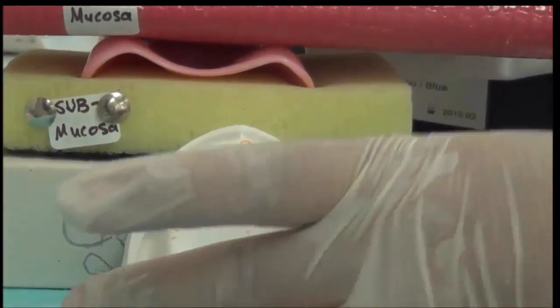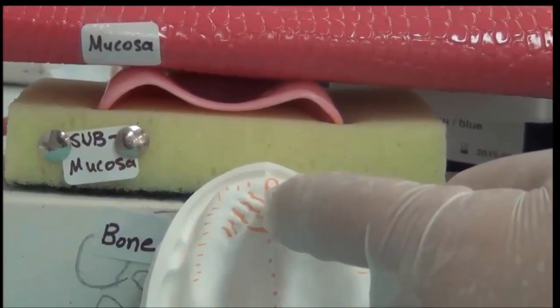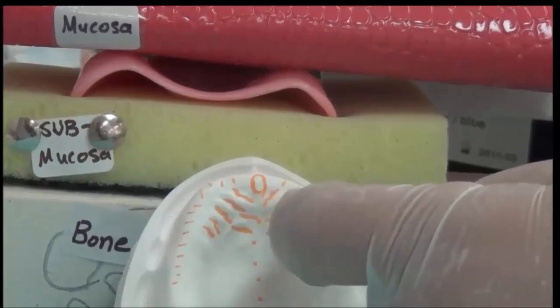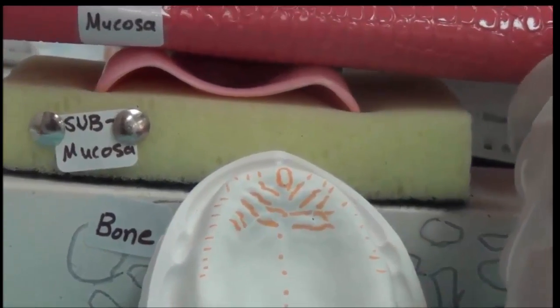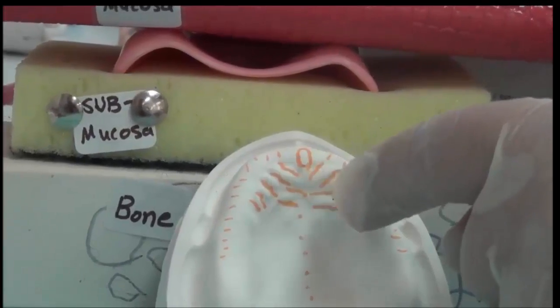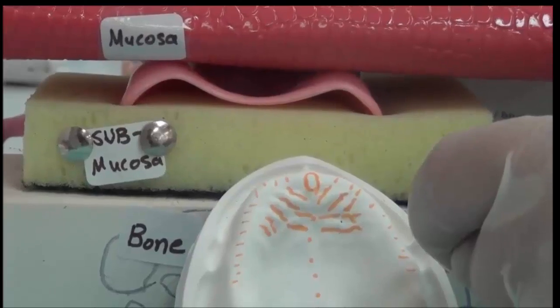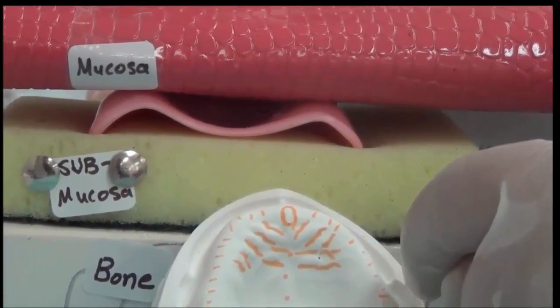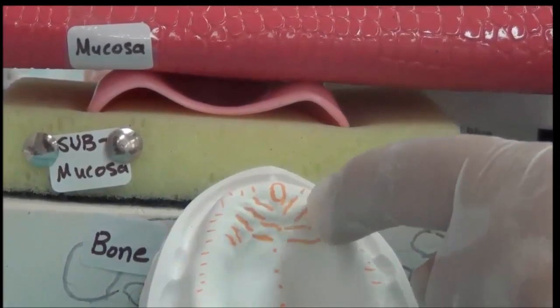And another reason why we need to relieve are the rugae areas here. This rugae area is a bit rough. This irregularity in the mucosa layer, or in the surface of that tissue, if under pressure, it will be squeezed underneath the denture and would not tolerate the denture pressure. So we need to relieve the rugae area.